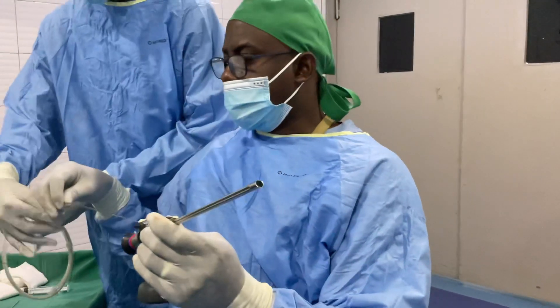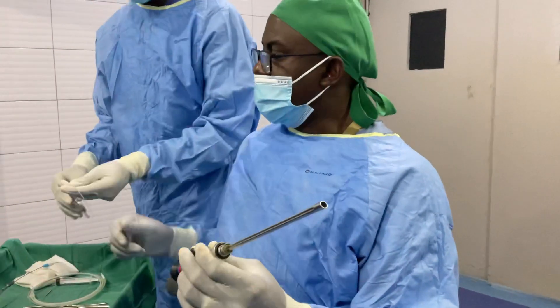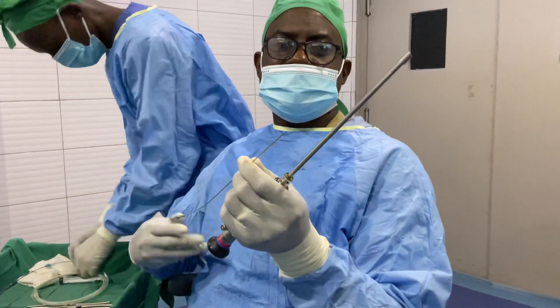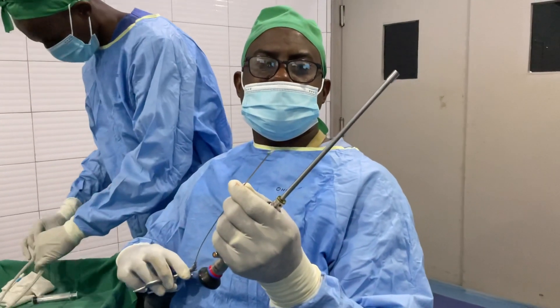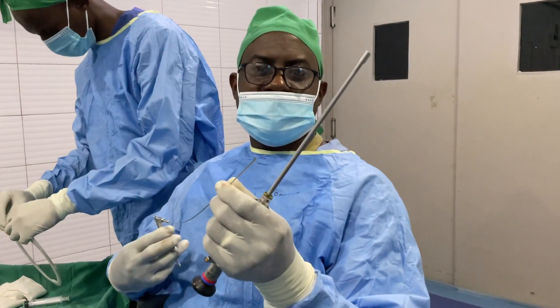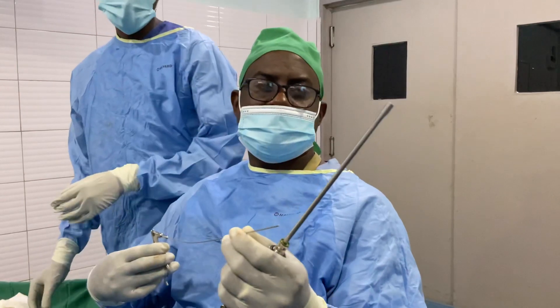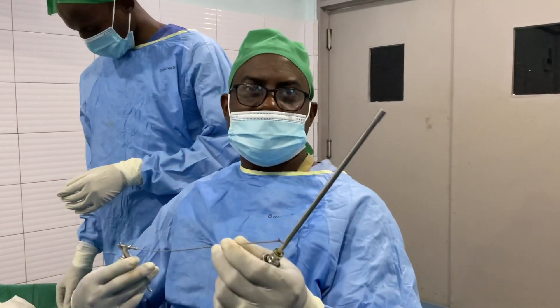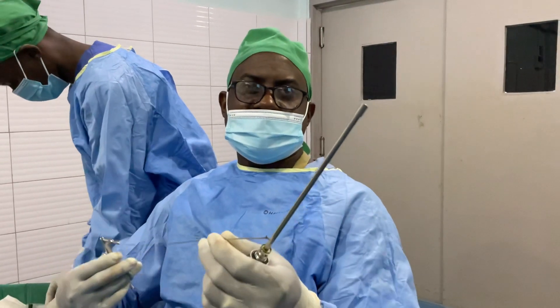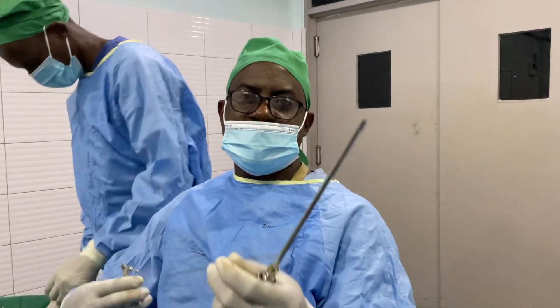You can also use a grasper — this is called the hysteroscopic grasper. We use this instrument to either remove debris from the endometrium or the ostia, or you can use it to remove polyps, small myomas, IUDs, and any other pathology in the uterus. You can even use it to take a biopsy.